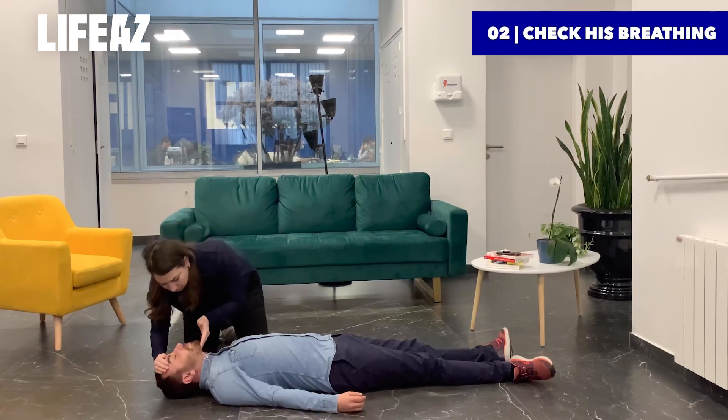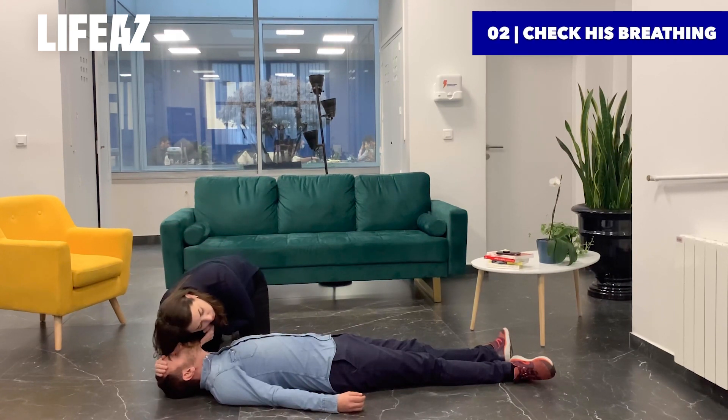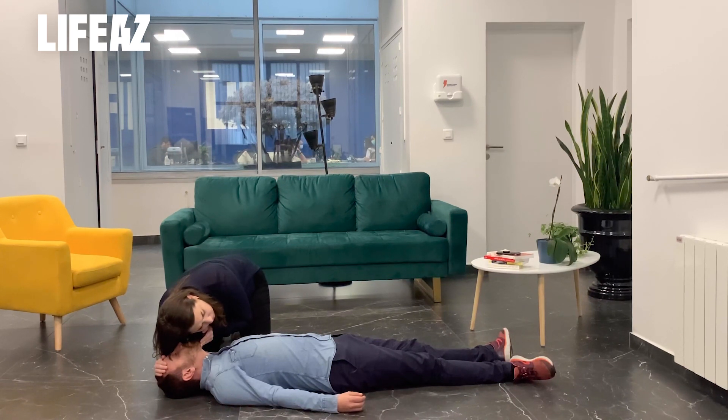If he doesn't react, check his breathing. Gently tilt his head back, lower your head, and watch for a rise in his stomach or chest for 10 seconds maximum.